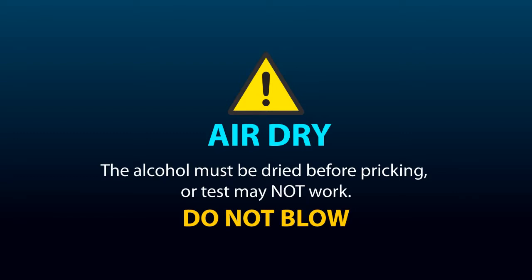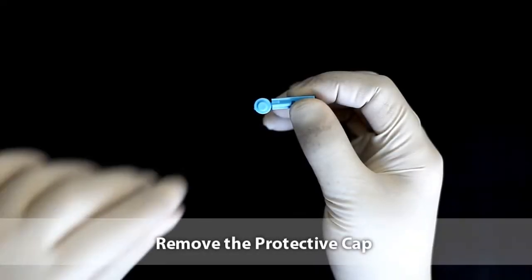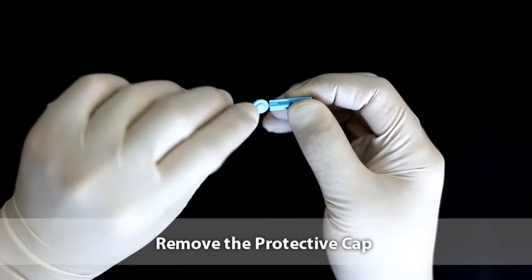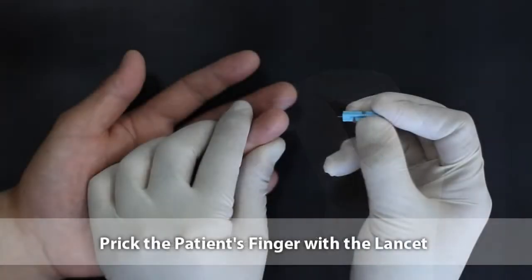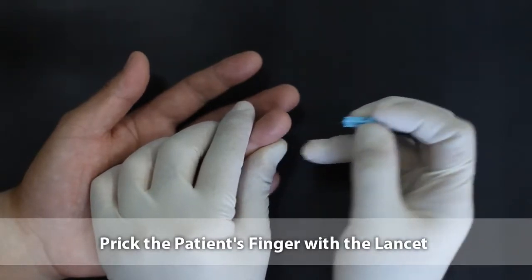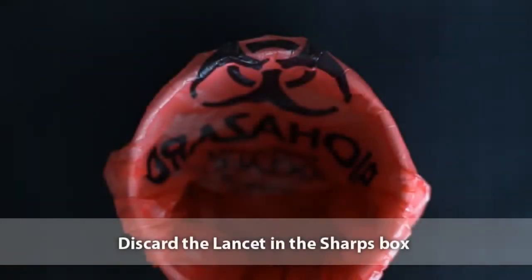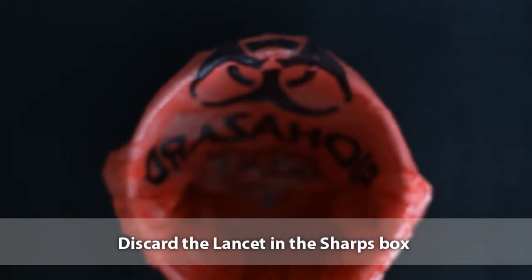Do not blow or wipe the finger when you dry. Discard the lancet immediately after pricking the finger.